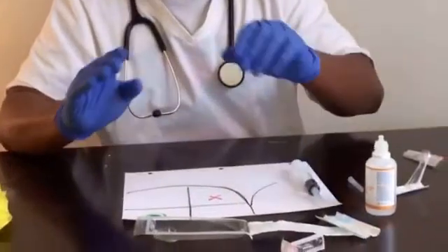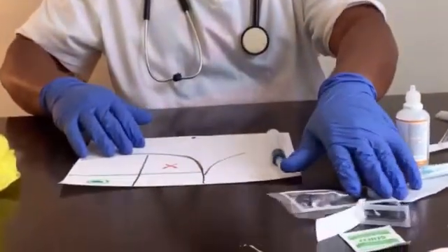Preparation is complete — your needle is attached and the product is inside. Now approach the patient. If the person can speak, introduce yourself: say your name and tell them you're going to give an injection. If the person is not responding, you don't need to wait — proceed to site selection. For intramuscular injection there are different sites: the gluteal (buttock), the shoulder (deltoid), and the thigh.